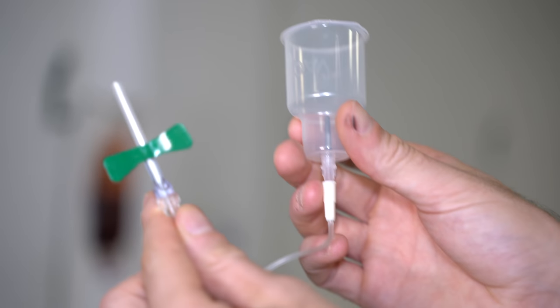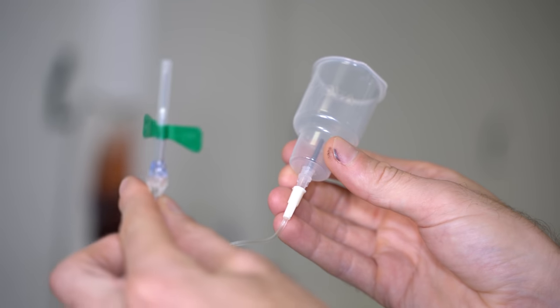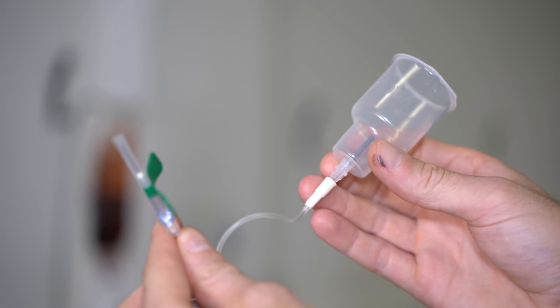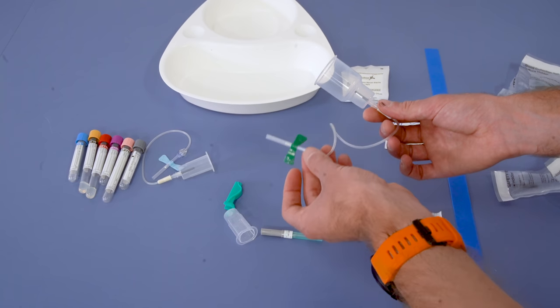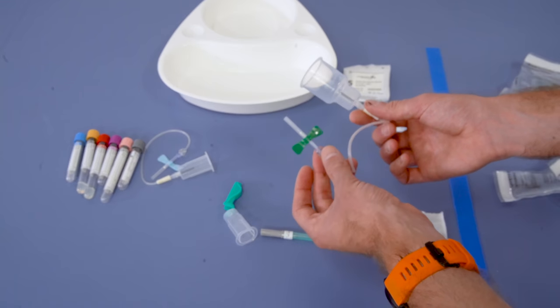We can also be opportunistic where we have much larger vacutainer sets where we will be able to take a blood culture bottle as well as our regular vacutainers. Here we've got a green, one of the larger gauge needles, but we've still got that extra flexibility with the connector.